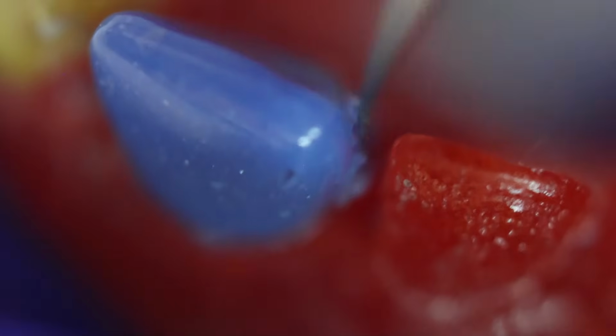Just removing this part would be a good idea. Yes, this was some extra part that was there.